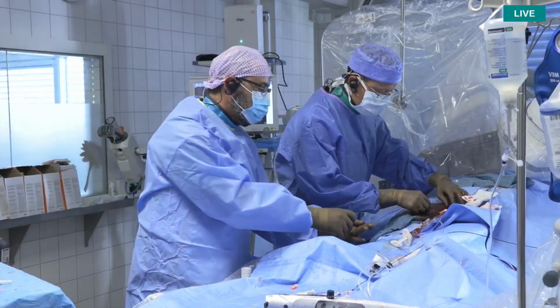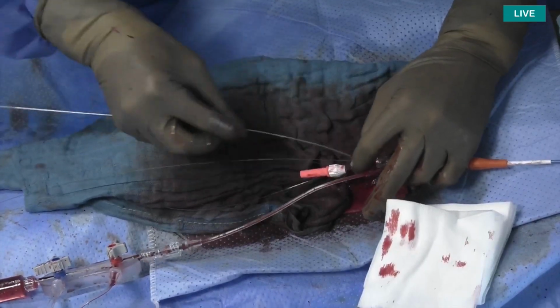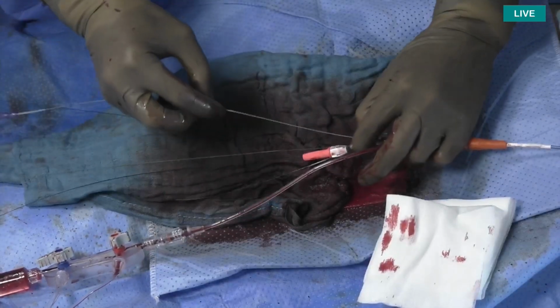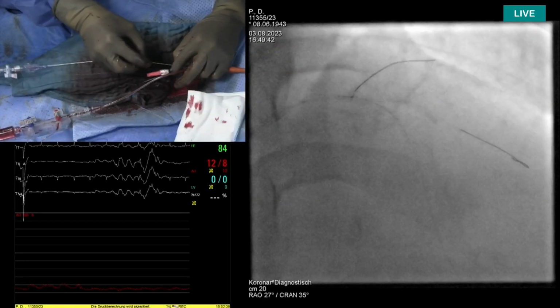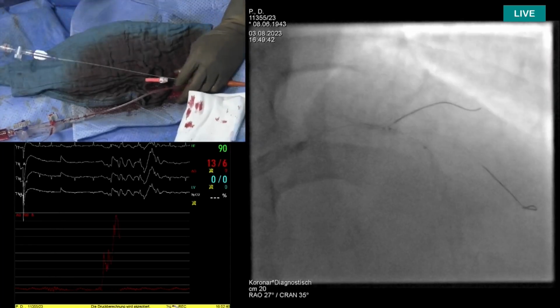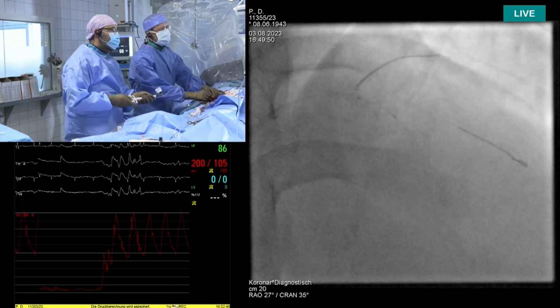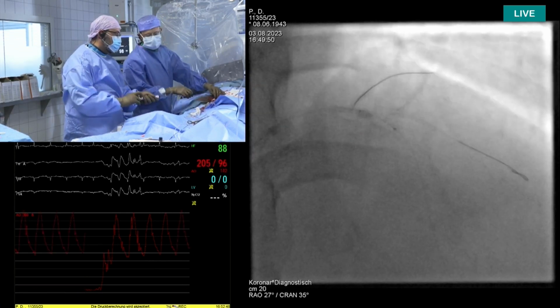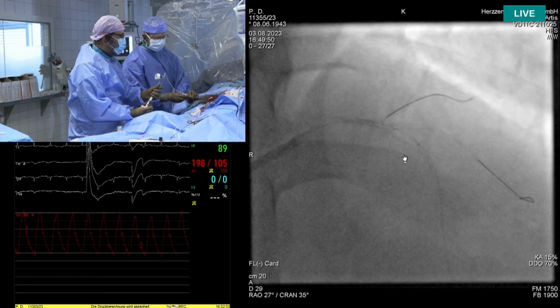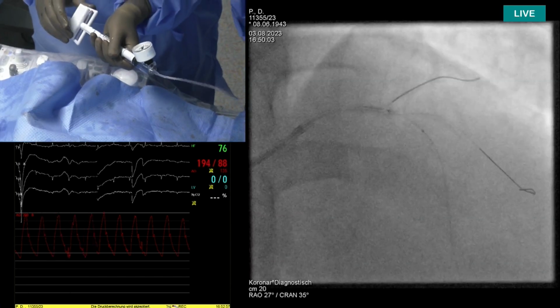So this is an important point, Rafa, actually, in general. If you want to use balloons to assess the success of lesion preparation, then these balloons obviously need to be big enough. So they need to be at least 1-to-1 vessel size. Otherwise, you will miss under expansion. One important aspect when you're predilating calcified nodule regions is always to take a look in two orthogonal projections so you can clearly confirm that the balloon is expanding properly.